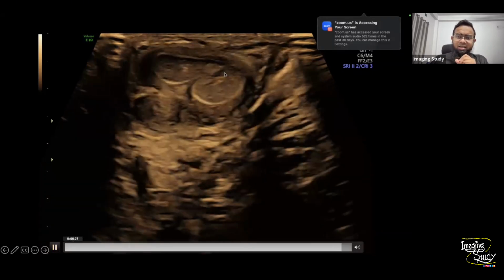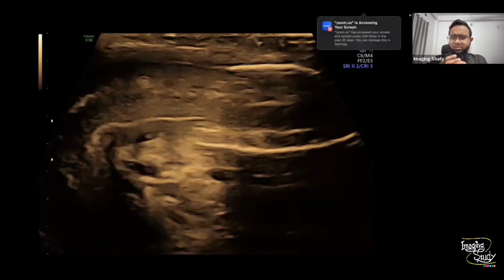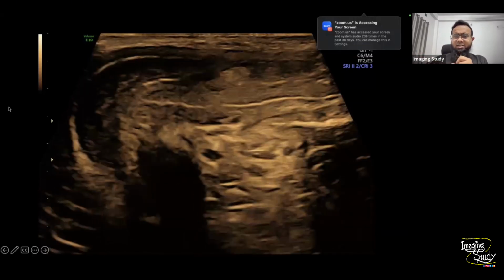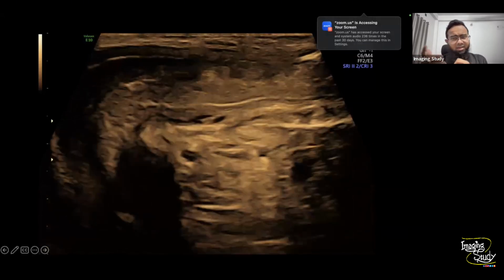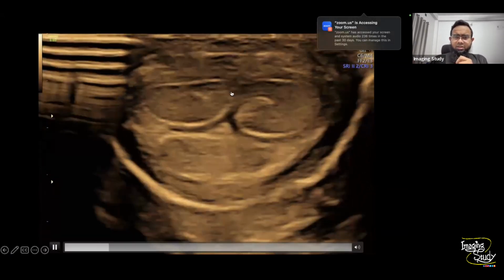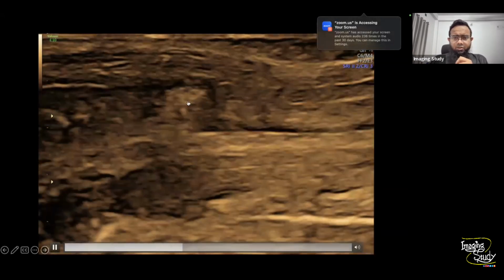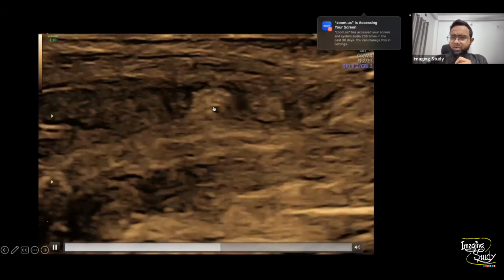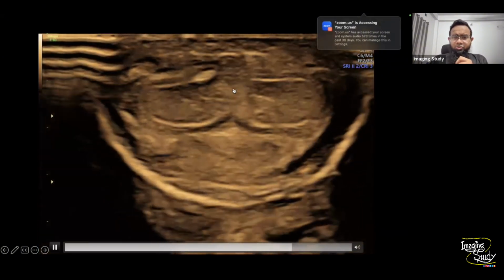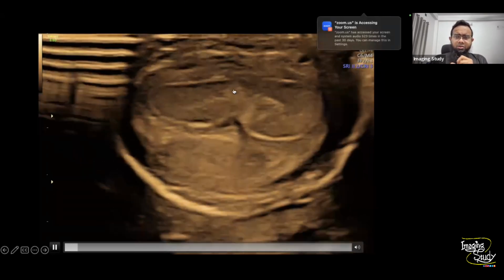In my country, I don't know why, this type of calcification of the tunica albuginea is much more common nowadays. So I get at least 2 to 3 patients every week. I don't know why. So this is the transverse section. Now you can see we have seen that echogenic area. Yeah, this one. So this is the echogenic fibrous plaque. So here you can see, due to the surrounding calcification, we have missed it previously.